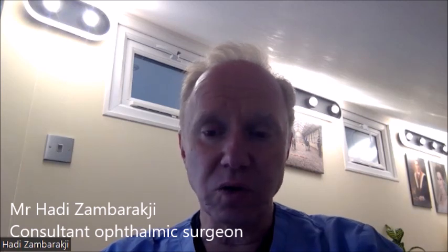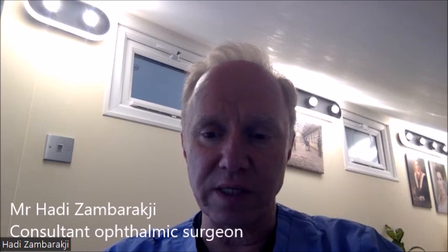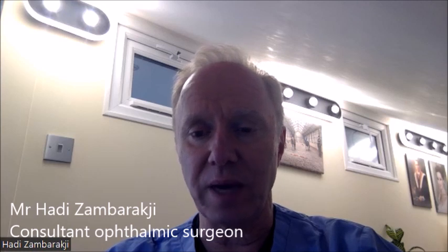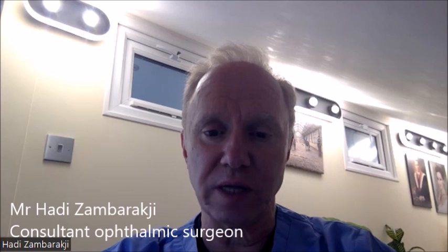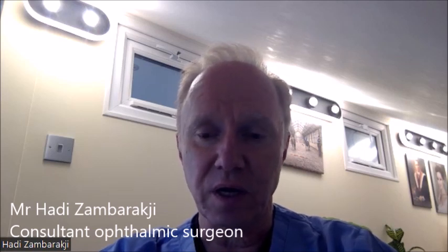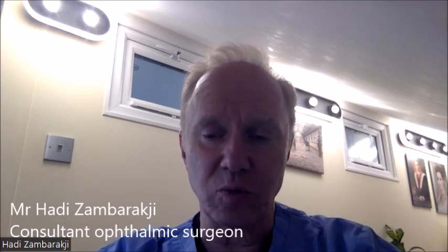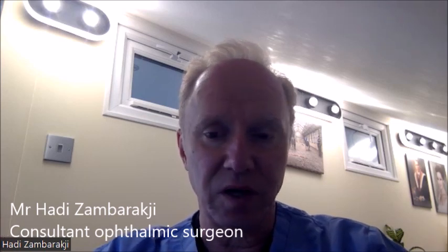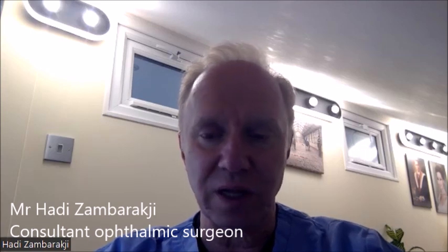And also, if you compare multifocal lenses with monofocal lenses, the contrast sensitivity that you achieve with multifocal lenses may not be as crisp as that with monofocal lenses, although the newer multifocal lenses are certainly of much better quality and can achieve quite good levels of vision. Having said this, it's important to bear in mind that multifocal lenses are actually excellent lenses that have taken years to design, and certainly the very modern ones are very good lenses.